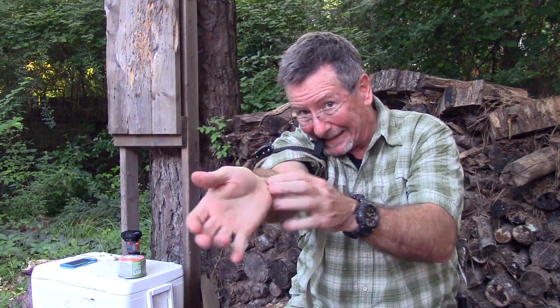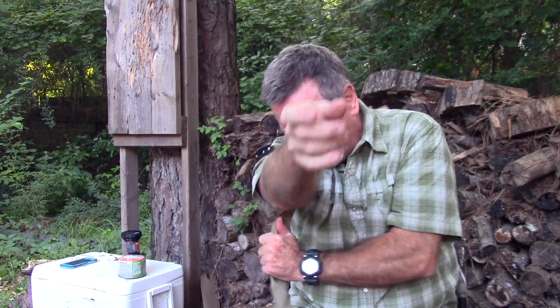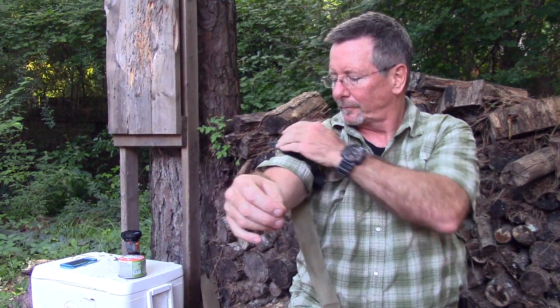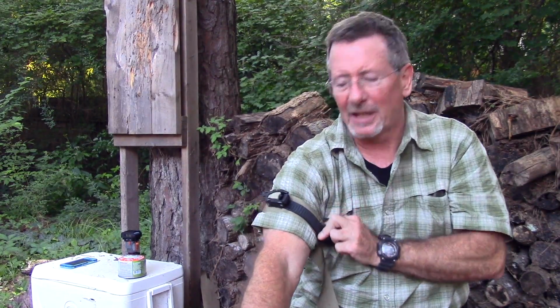And you're bleeding the whole time here. So I got it pretty tight. I don't think I got it as tight as I did on my leg. Then you start ratcheting, right, like so. And I think you can probably get it tight. It feels pretty tight now. And my understanding is, if it doesn't hurt, it's not tight enough.